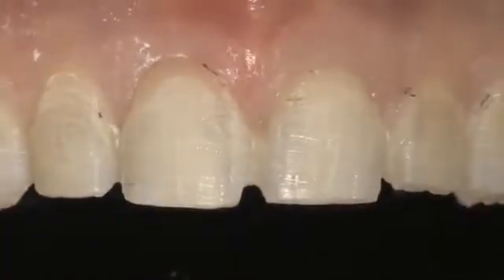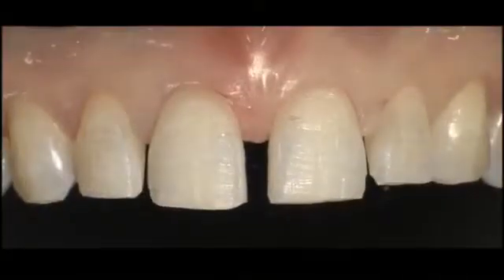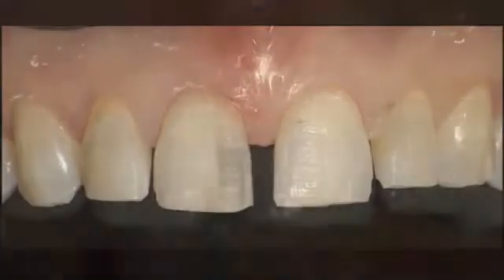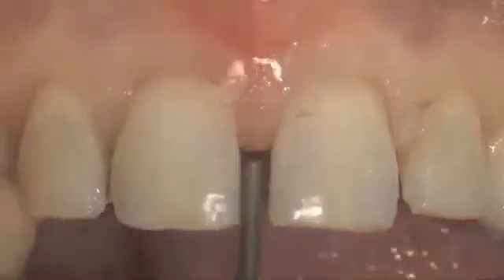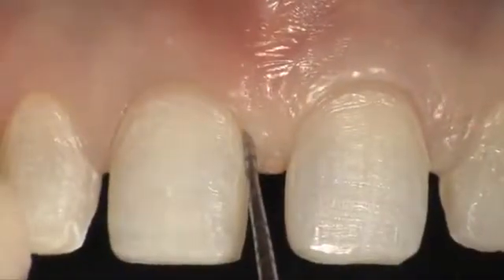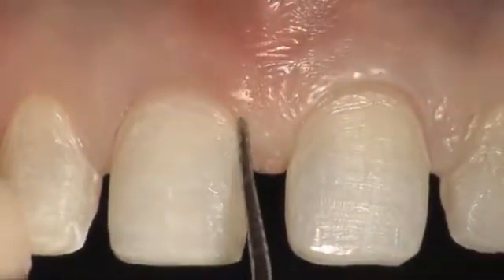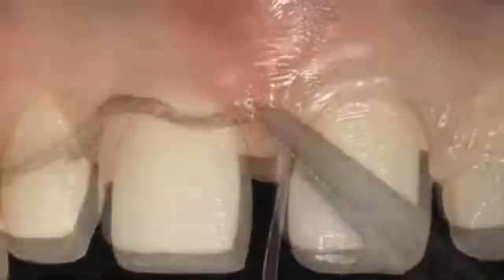Particular attention should be paid to the soft tissue, especially during the finish line preparation. The use of a double zero cord will displace the soft tissue, giving the opportunity to prepare a light shoulder, avoiding contact and consequently bleeding of the surrounding tissue.